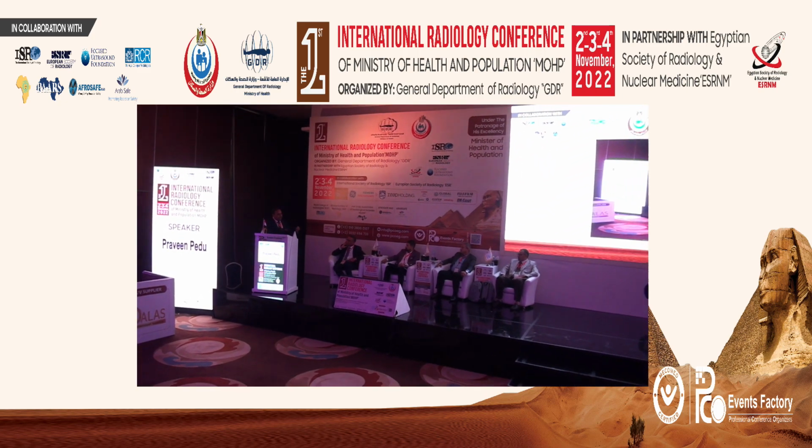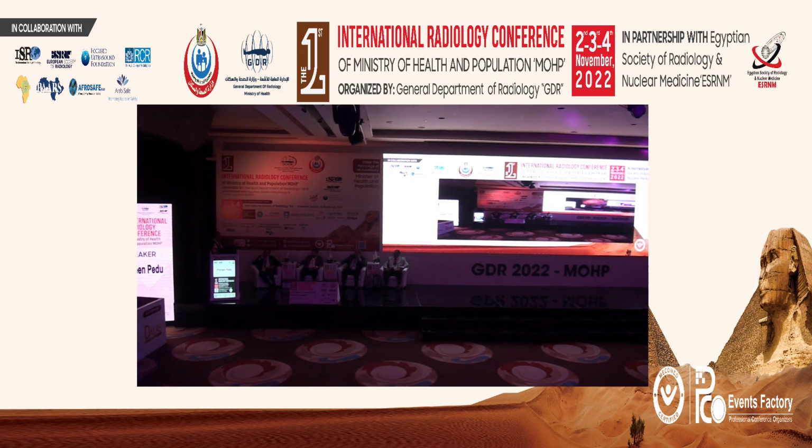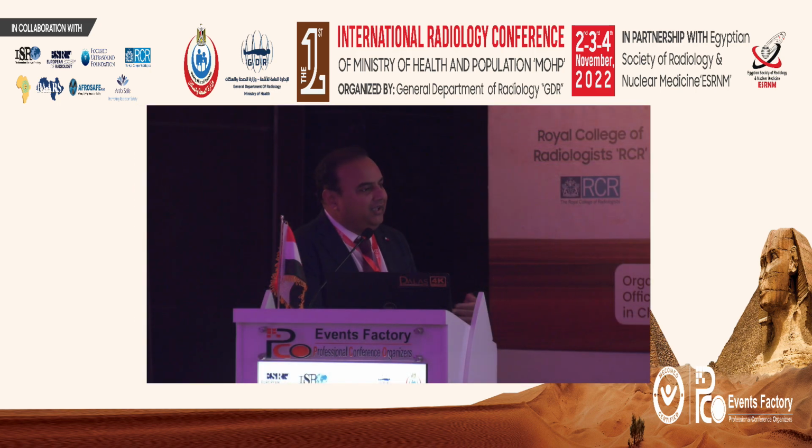But when you have a lesion which, say, 2.5 centimeters, situated right next to the main portal vein or the main hepatic vein, and the patient is not suitable for a big operation, which involves a hepatectomy almost, then you could consider IRE in those group of patients. So what I'm trying to emphasize is IRE or any ablation is not a substitute for radical surgery, resection, because surgery still carries the best long-term prognosis, but it's there to help those group of patients which are unsuitable or to extend the scope of resection when you have a lesion on the other side which is situated in a critical position. So it's very problematic.